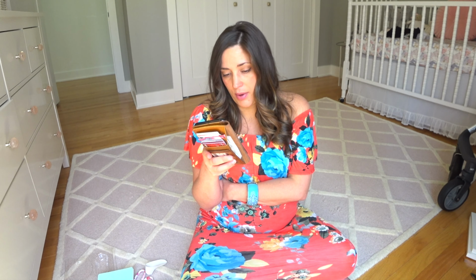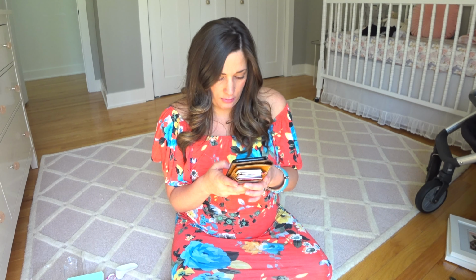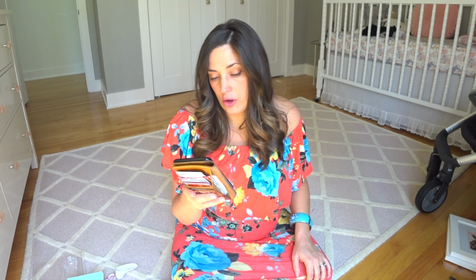Where's the other Owlet app I downloaded? Okay, so I have the Owlet, and it says join Owlet. Set up my device. There we go. So they want your email and for you to set up a password. Put in your name, last name, phone number, and then you create an account. You will receive an email confirmation link, which I did. There's a weird code. Okay, so I got an email, says to confirm it. Click on this link. I have successfully confirmed my email and allow for notifications.